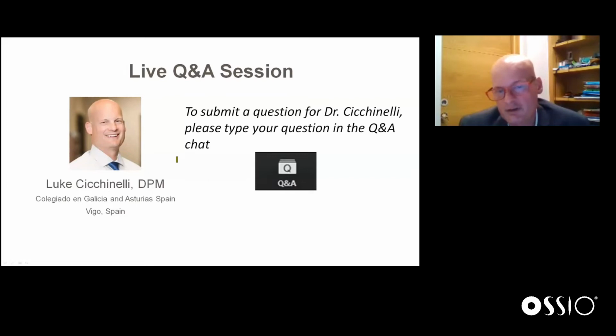Well, I'll start first, and then Chris, please respond as well. So I haven't seen that happen yet, but if it did, there would be between no need to remove it at all or simply cut through the area and re-drill and put another implant in. It would depend on how far down the road that complication happened. If it was 2 years down the road, well, probably that doesn't exist because the implant has already osseointegrated. If it was some sort of issue, 2 months to 4 months or within the first year, well, the clinical decision would be made based on the presenting circumstances. But that's always been another one of the benefits to absorbables and these types of products, is that any sort of revision, should it ever be necessary, is even easier.